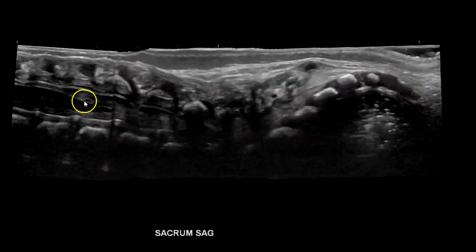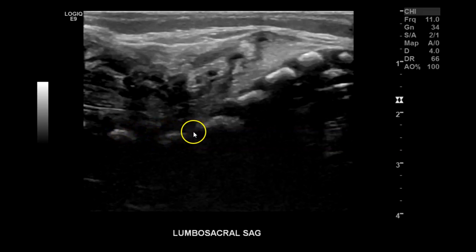If the baby moves too much, I'll start from the top and work my way down. Counting down: 5, 4, 3, 2, 1 — this is L1. The lumbar vertebrae are usually pretty horizontal, and then the first sacral element will start off at an angle.